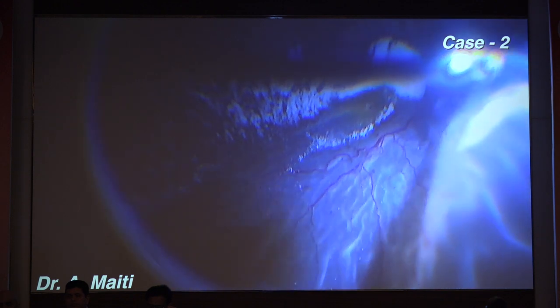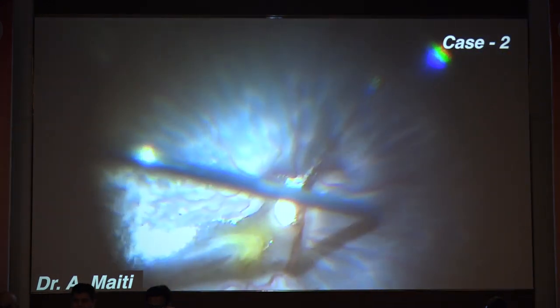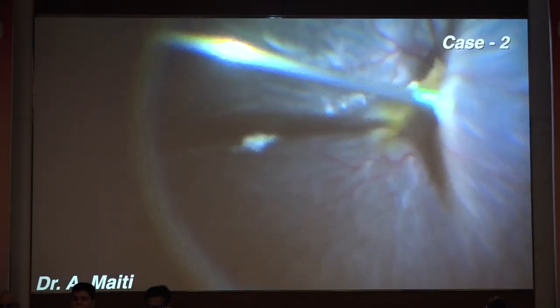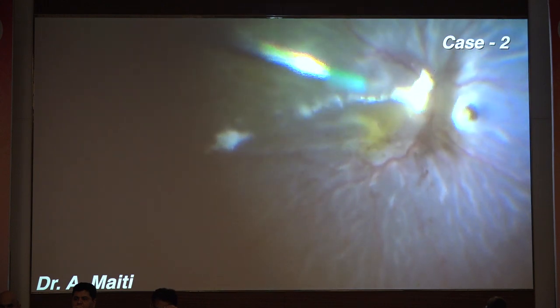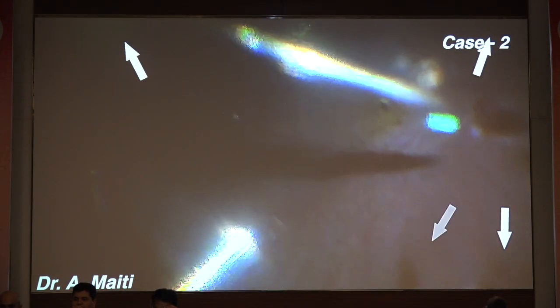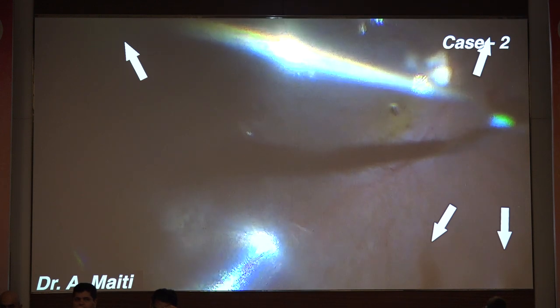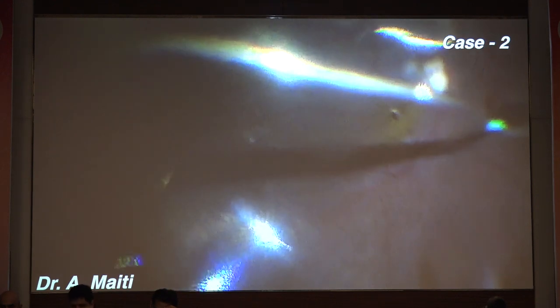Doing a proper vitrectomy and a wash, it didn't look that bad, that stiff retina. When I was draining on the nasal side, thick fluid was coming out. And now something unusual happened. From all the quadrants, you can see the retina had split. There's a tension, a retinotomy has happened. It was at least 20 splits in the retina.